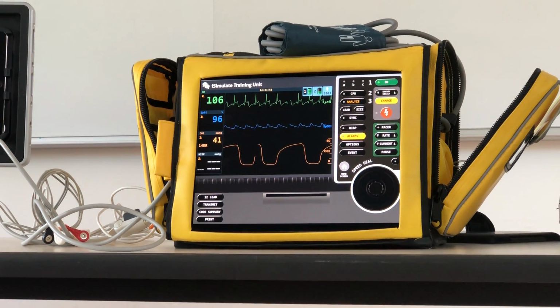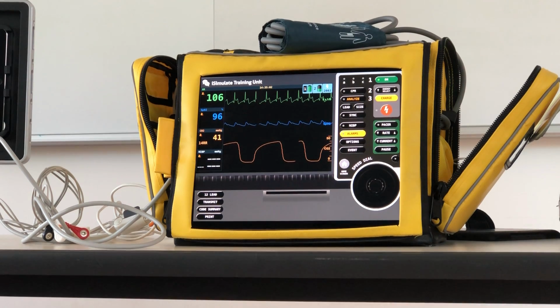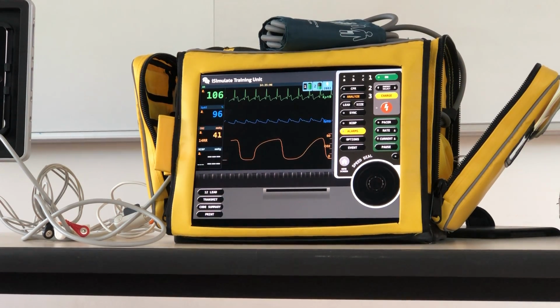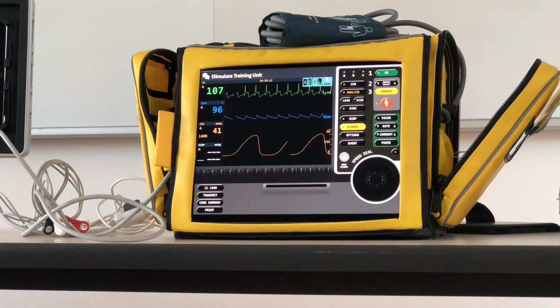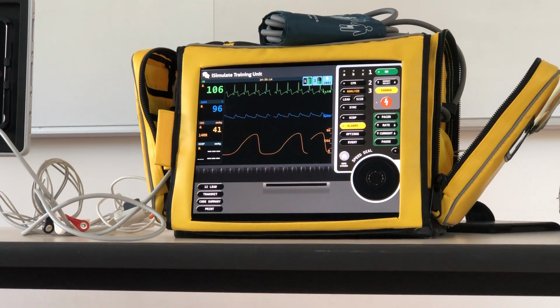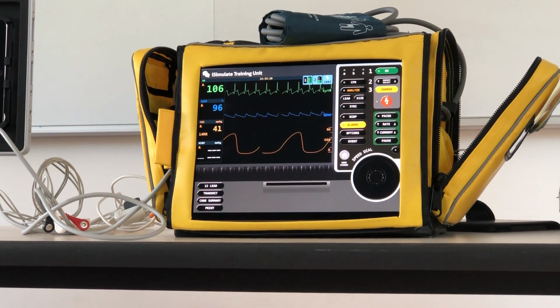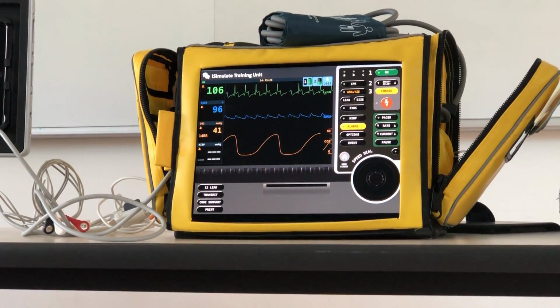And it's kind of nice because just like I did with the other example, you can give them someone with significant bronchospasm and a rapid respiratory rate and lots of evidence that they're not doing well. If they go down the right path, they provide a breathing treatment, you can dial it back to that partial bronchospasm over 3 minutes or over 10 minutes, whatever, and prompt them that maybe they need to do further treatment. They do more treatment, you take it all the way back to a normal waveform. So you can just tweak it as you go, which is kind of nice.